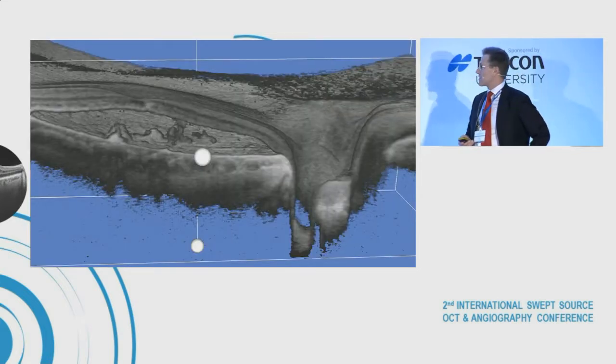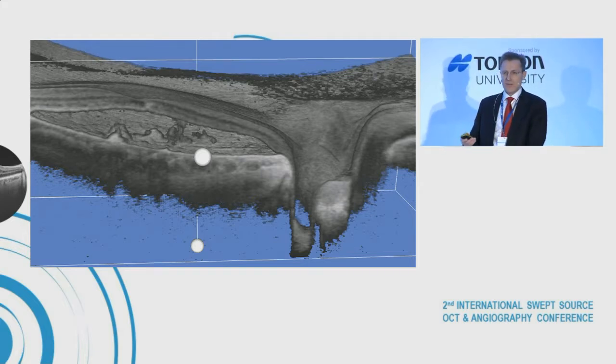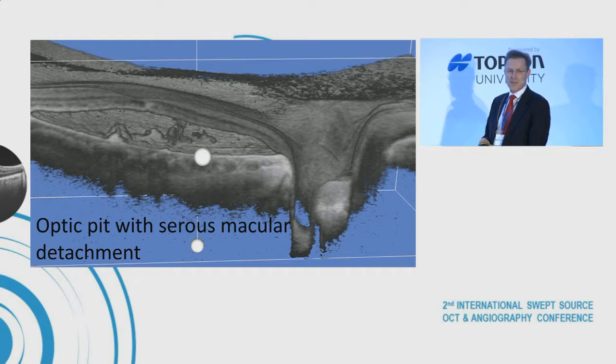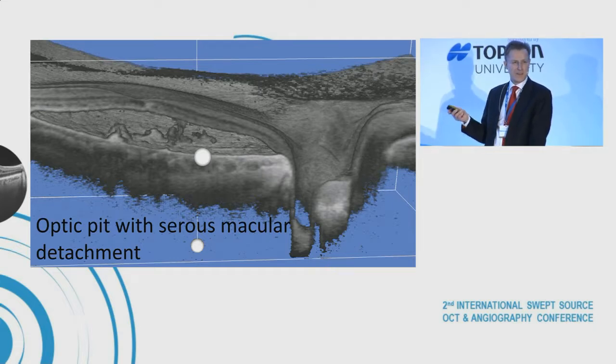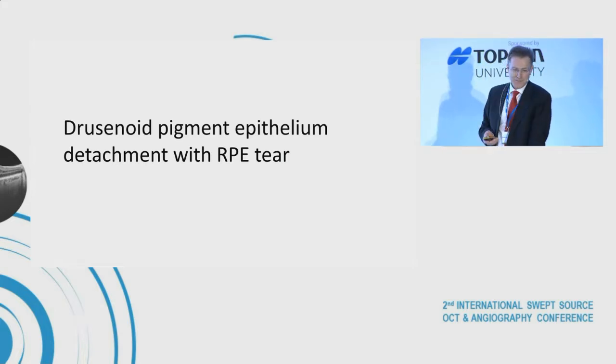So these are some of the wonderful things you can see with 3D rendition. And I think the problem with OCT, as Professor Drexler also showed, is that it's developing so fast that we don't have time enough to learn all the wonderful things you can actually do with it before you have the next generation of instruments. So I encourage my residents to do OCT themselves, because nurses are never going to figure out the mysteries of the retina that you can actually unravel with this beautiful instrument.